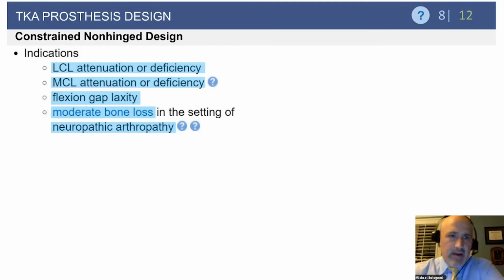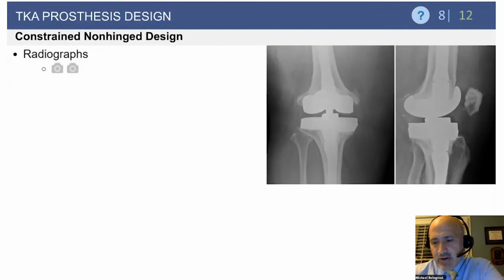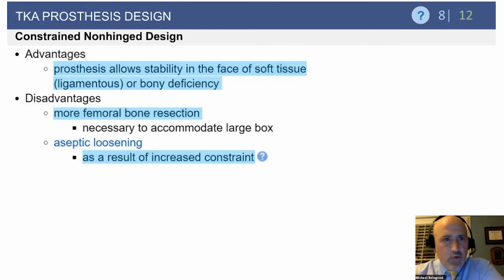Constrained non-hinge design indications: LCL attenuation or MCL attenuation or deficiency, flexion gap laxity because the post is higher and the box is deeper, and certainly considerations in neuropathic arthropathy with moderate bone loss. You'll see some questions come up. Here are some radiographs. Just remember, that non-hinge design is not going to show a true hinge or bolt across the femur. It may show metal reinforcement within the post, and that's a tip-off that that's what you're dealing with.